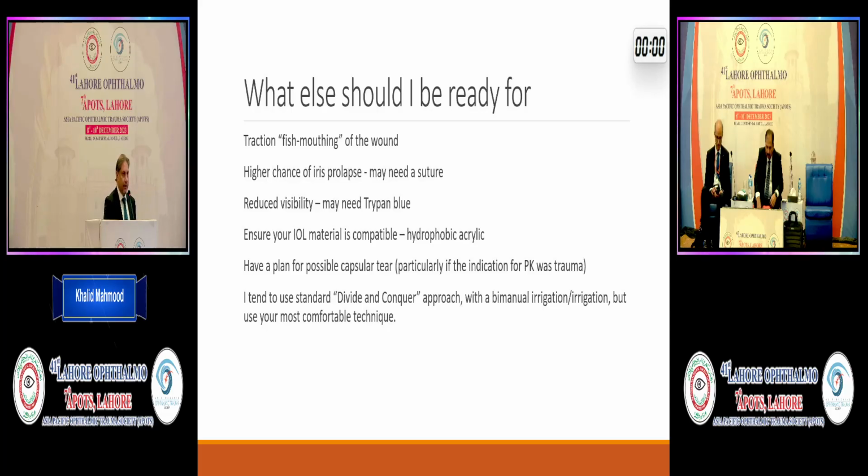So the key message is that when you have an added maneuver, you have added risks. So the most important message is that in these cases, when you are dealing with cataract in corneal transplant patients, please, you have to save the corneal endothelium. And that is the most important point. Thank you very much.